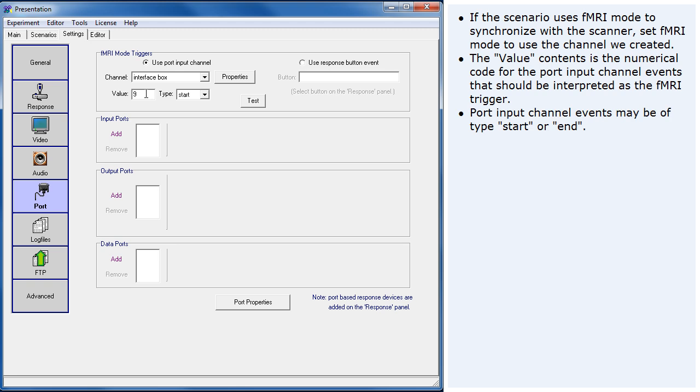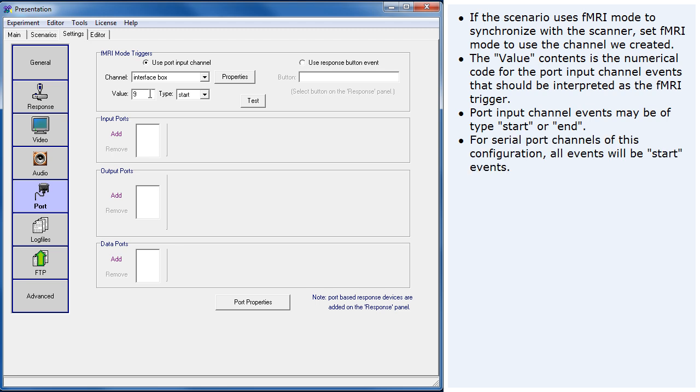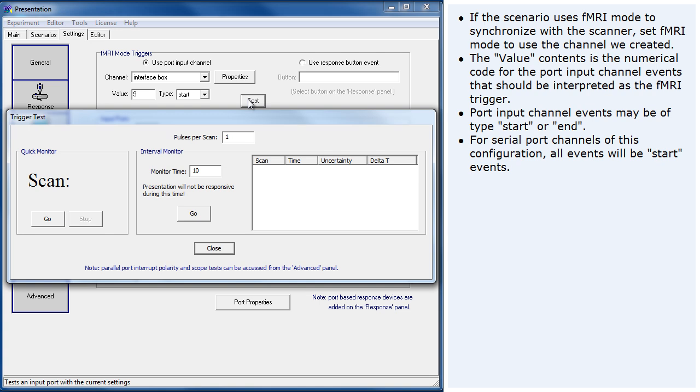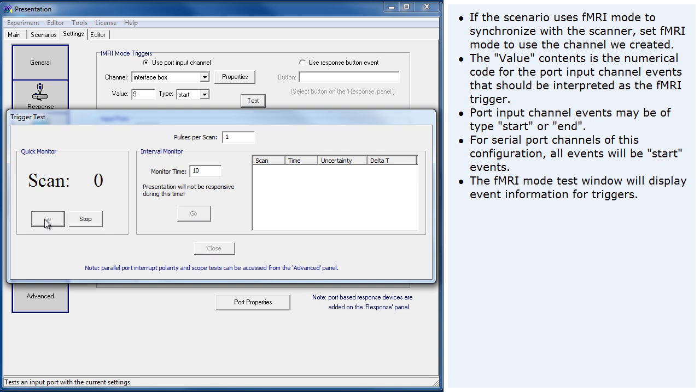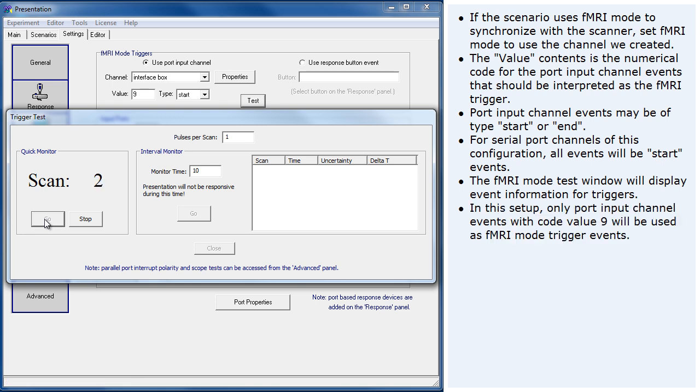Port input channel events may be of type start or end. For serial port channels of this configuration, all events will be start events. The fMRI mode test window will display event information for triggers. In this setup, only port input channel events with code value 9 will be used as fMRI mode trigger events.